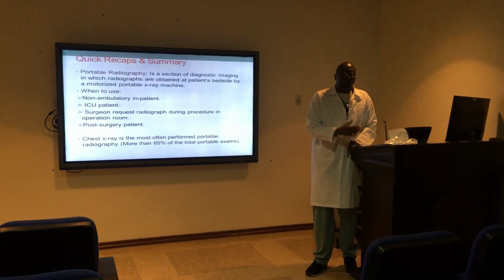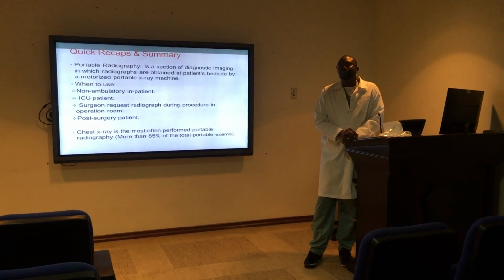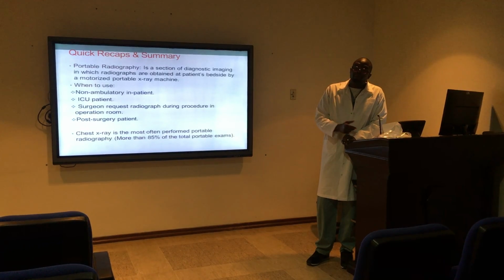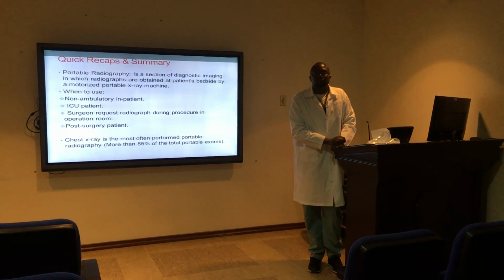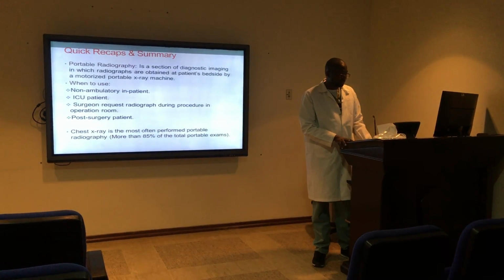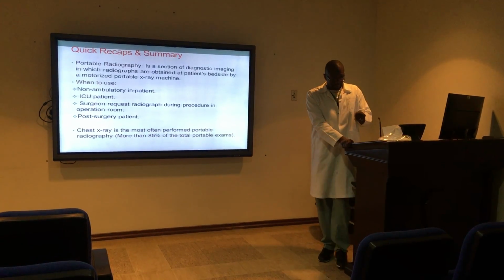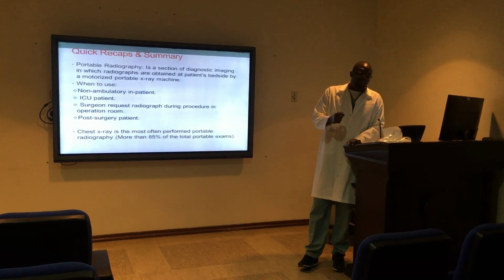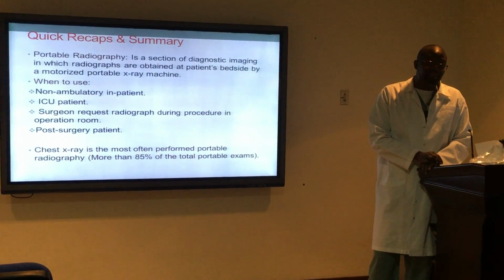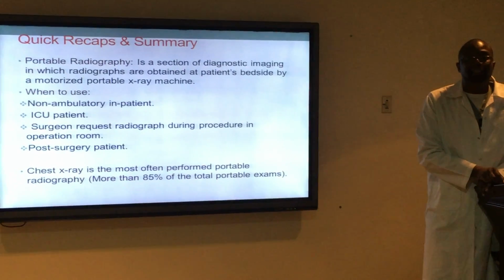or when the surgeon requests a radiograph exam during a procedure. Lastly, for post-surgery patients who cannot be moved to the diagnostic department for their exams. And now, as we all know, 85% of the portable exams performed in most hospitals are chest examinations.